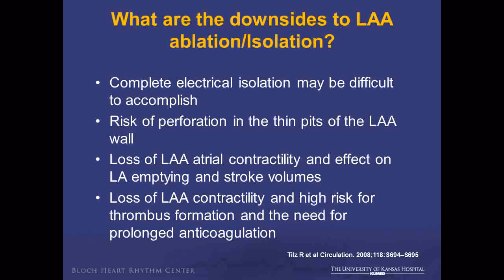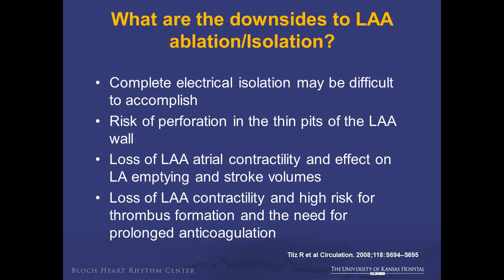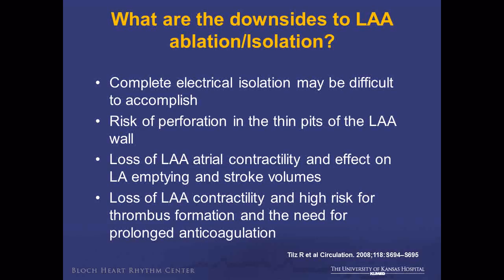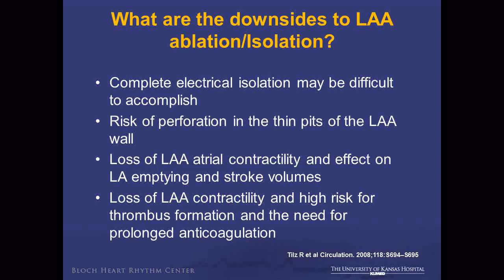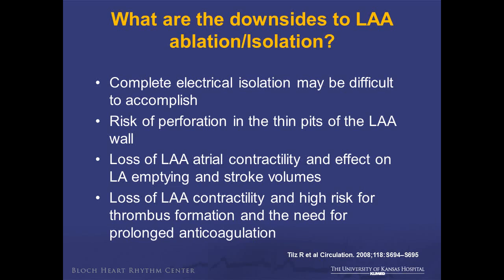So what are the downsides of left atrial appendage ablation or isolation? Oftentimes it's technically very challenging, and a complete isolation is not possible. Risk of perforation. You have seen Sam Asirwadan's pictures yesterday, all these little crypts, and they are paper thin. And any time I'm telling my interventional colleagues we're ablating around the appendage, it's like, what the hell are you doing? It's just something inconceivable.